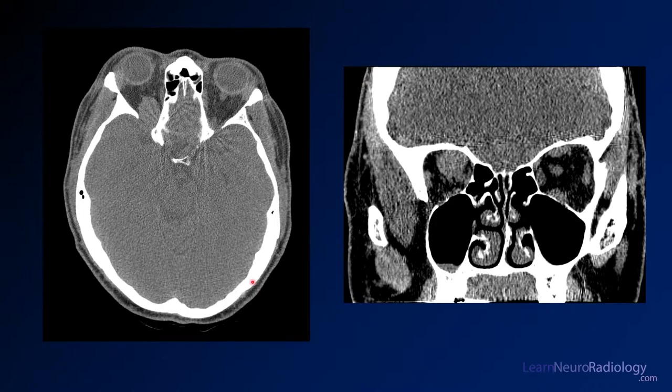Here we have some images from a CT through the orbits. We've got double vision, so we're thinking about orbital abnormalities — take a look at the orbits.